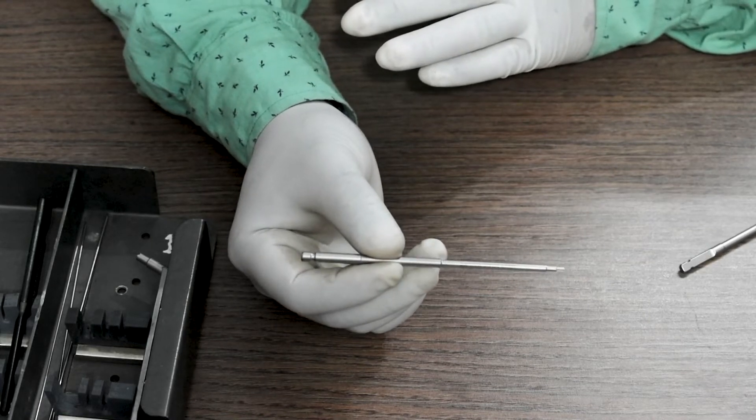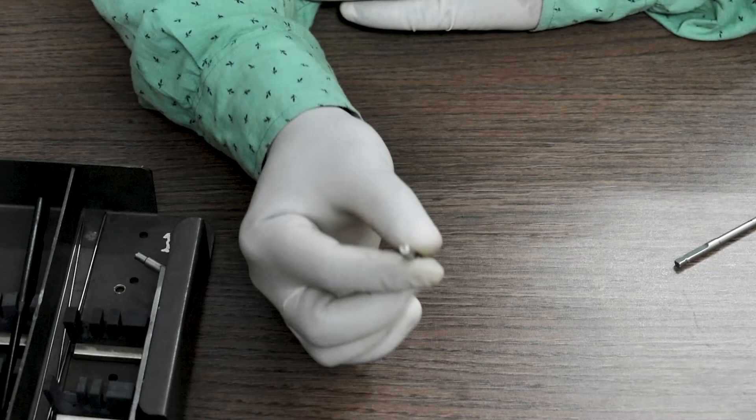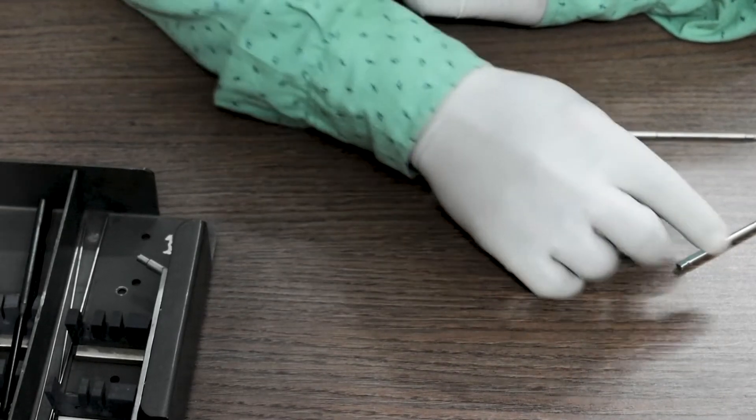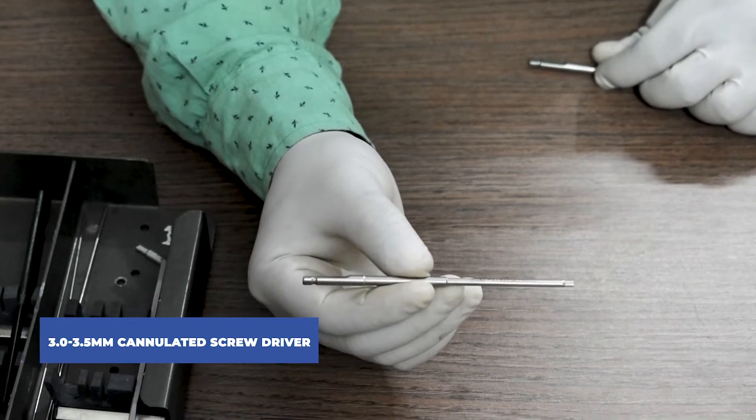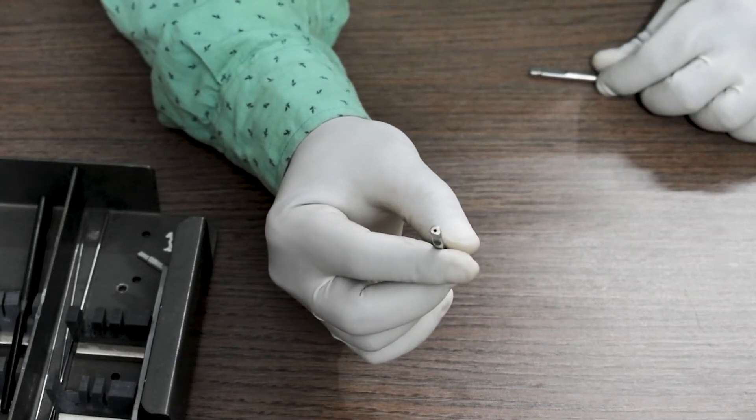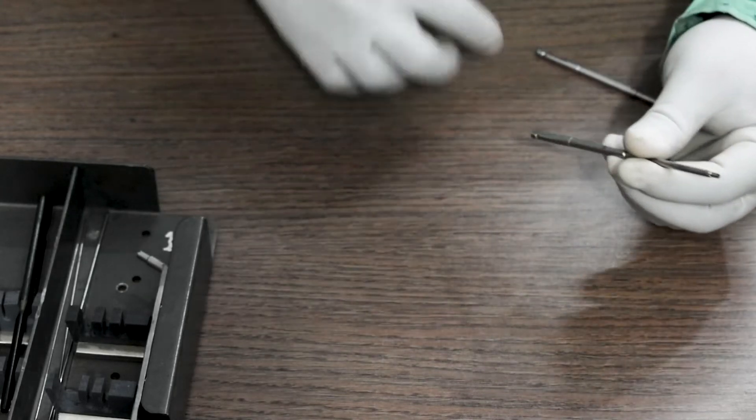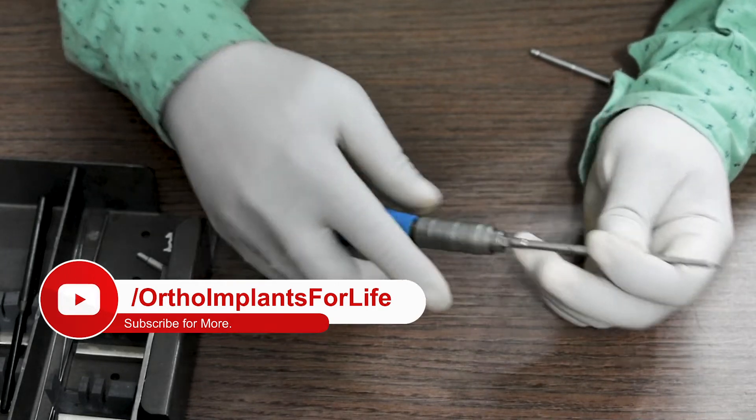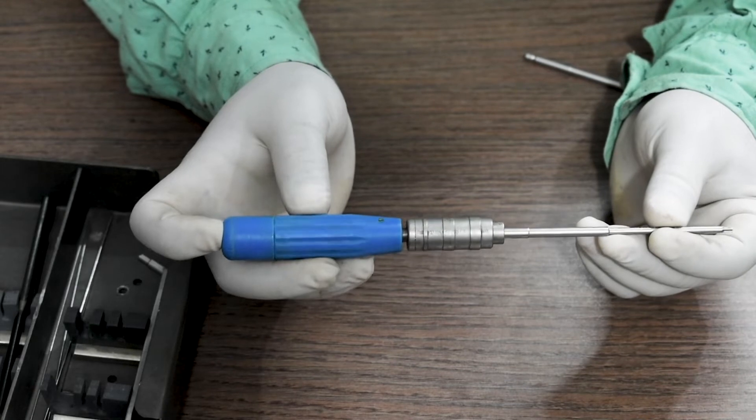with a Quick Coupling handle. As you can see, this is cannulated. This one is 3mm and 3.5mm cannulated screwdriver. You simply connect this with the QC handle as an attachment like this, and you can use this for the procedure.